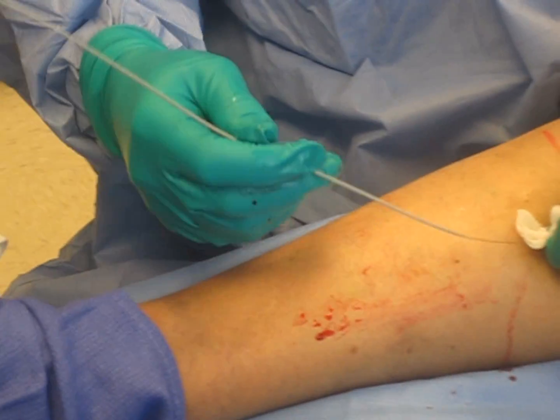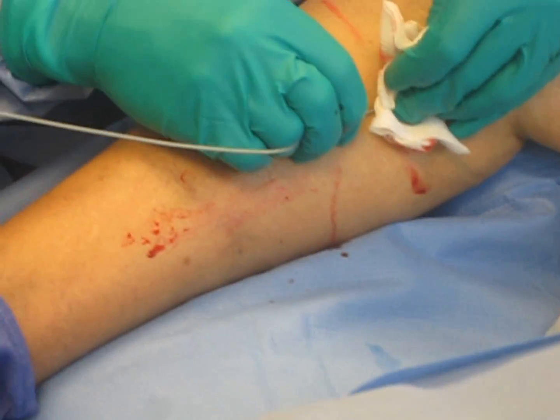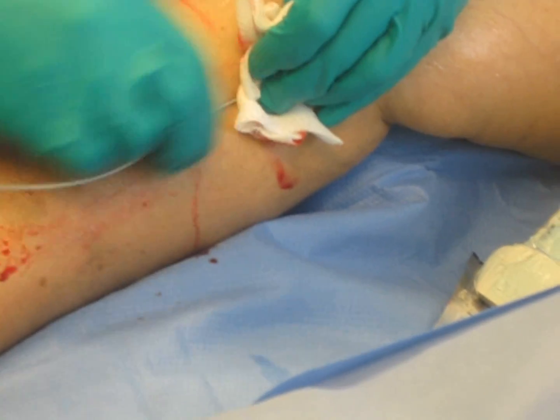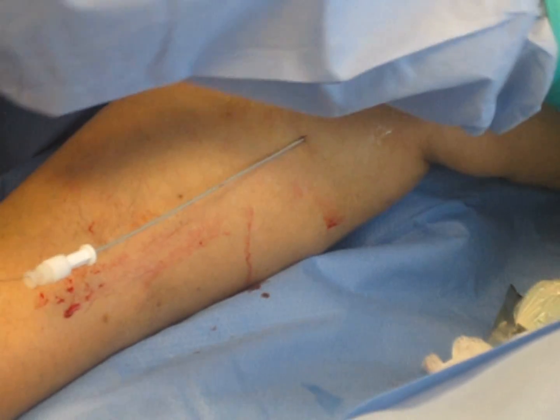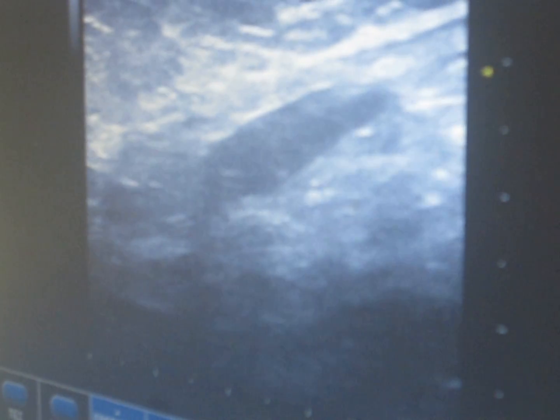Nancy's bringing this little catheter over the guide wire. Her veins are real tender. This is the typical scenario for the patients. We're going to bring our catheter up the vein — you can see it kind of glide up here. Right there — you can see me pushing it, just that little bright light.